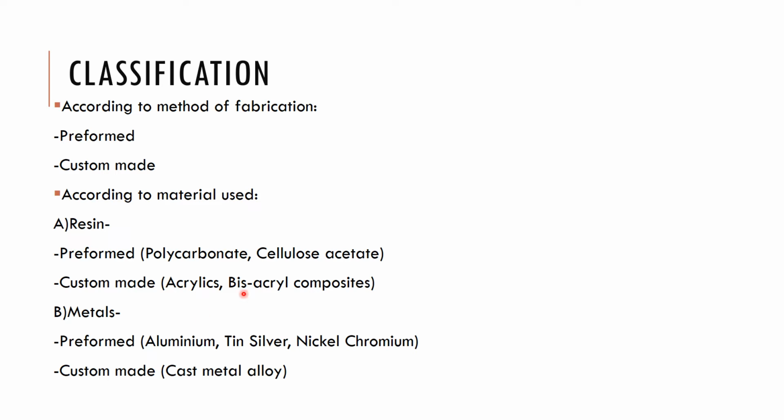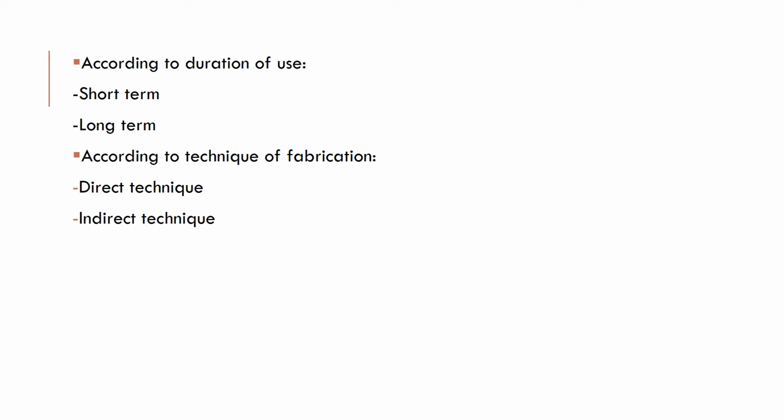We are using acrylics here, yes guys, and these acryl composites. Metals are also preformed, custom made: aluminum, tin, silver, nickel, chromium, cast metal alloy. We are not using those.